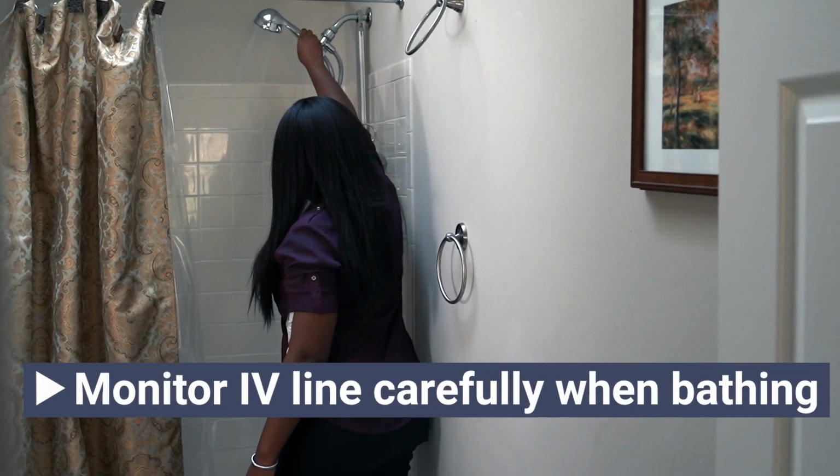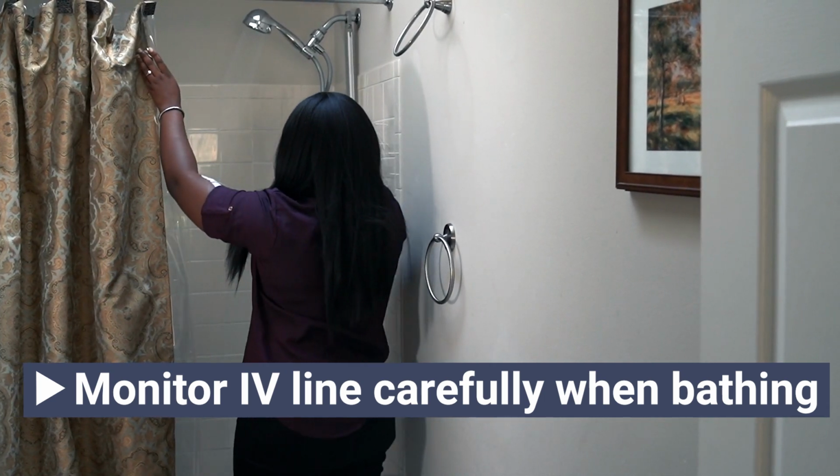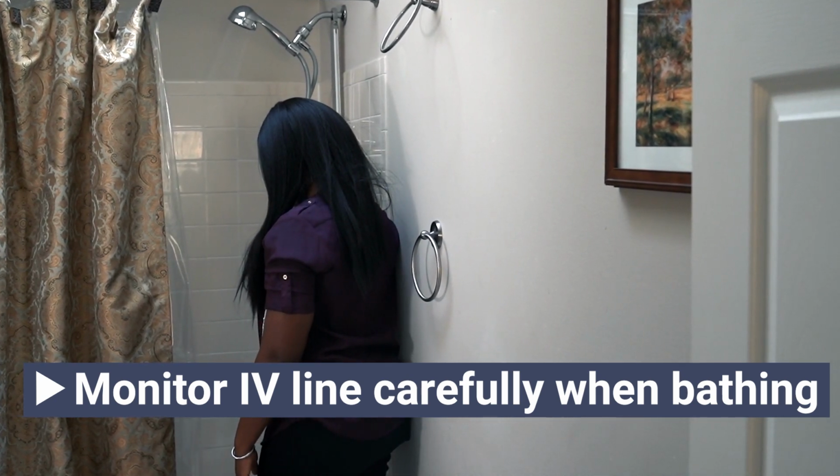Be sure to monitor the IV line very carefully when bathing. Keep the IV line close to your arm by securing it with a mesh sleeve or sock when you are not using it. This will make it less likely that the line could get pulled out.